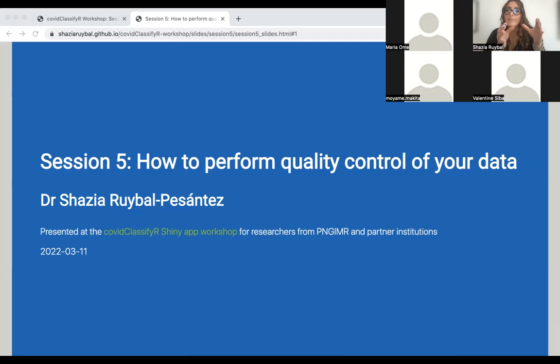And then generate your processing and your QC report for that one. You would want to put in the notes, this is condition 1 from plate 2, for example. Then you rerun the app processing for the other half of the plate, and write in your notes, this is second half, plate 2. You would fill in your plate layout only with the samples you want to analyze for that particular half. Does that make sense? Yes. Excellent. Great question.